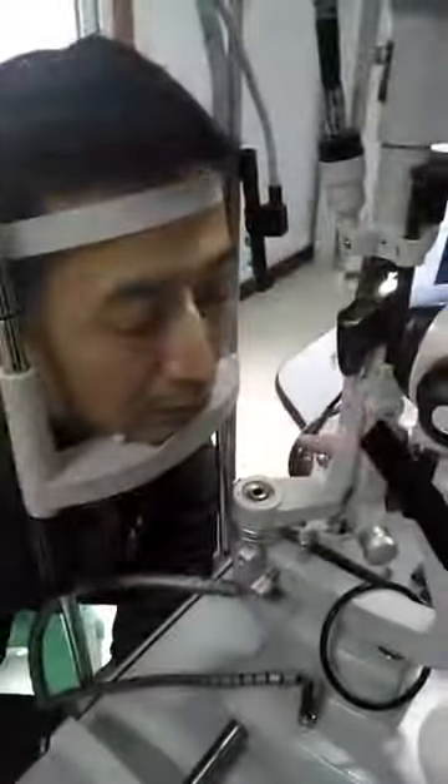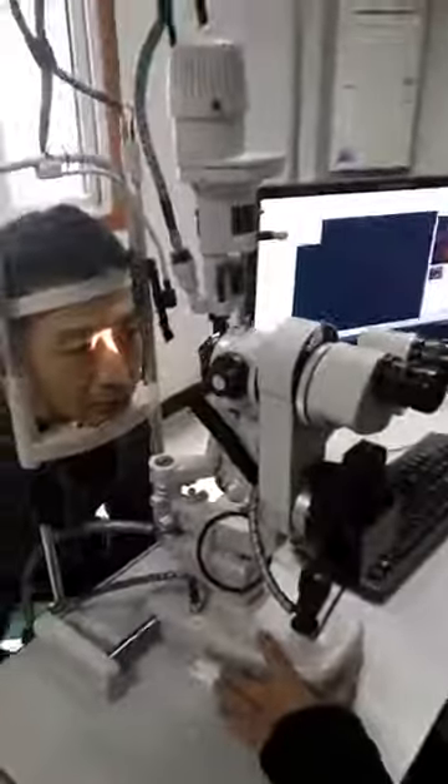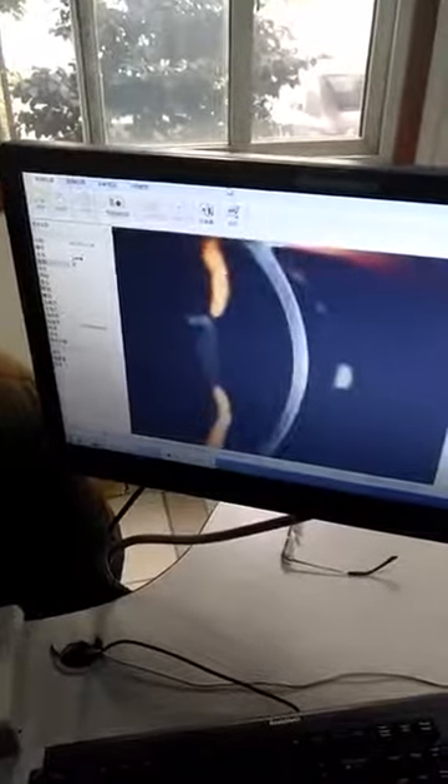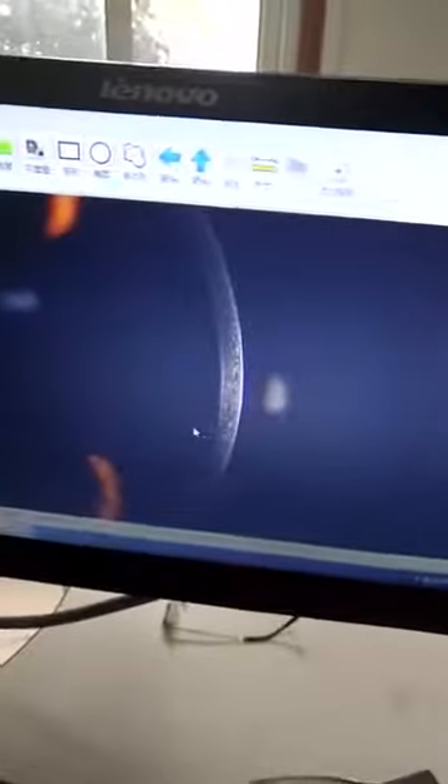Now we show how to take a corneal image. The corneal is clear — press the button. Double-click on this picture. It's very easy to operate the device and easy to get a good picture.